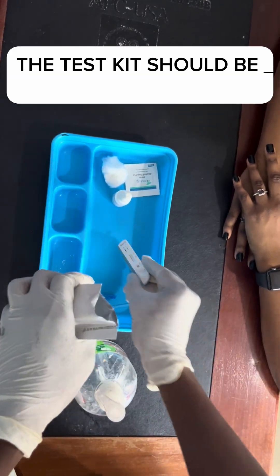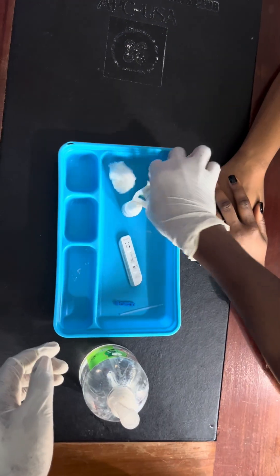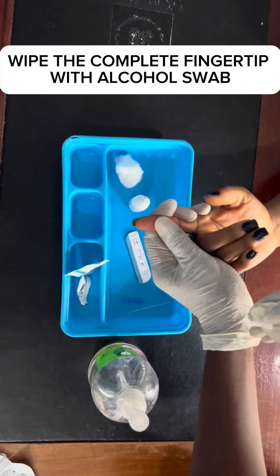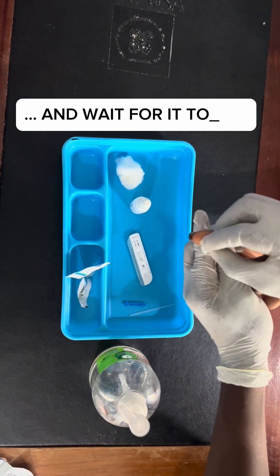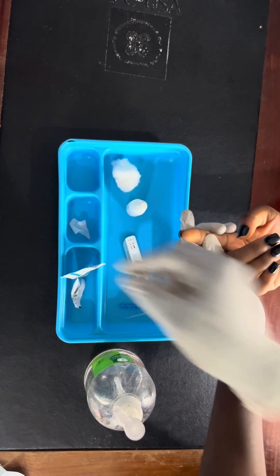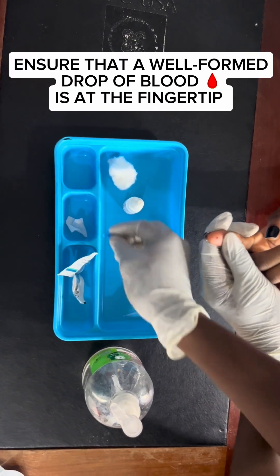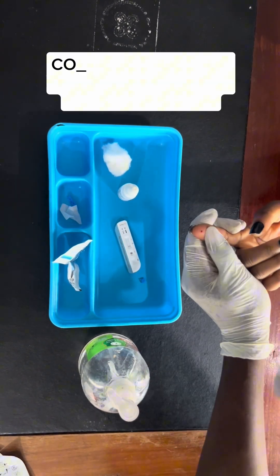The test kit should be on a flat surface. Wipe the fingertip with an alcohol swab and wait for it to dry. Detach the cap of the lancet and prick the chosen site. Ensure that a well-formed drop of blood is at the fingertip.